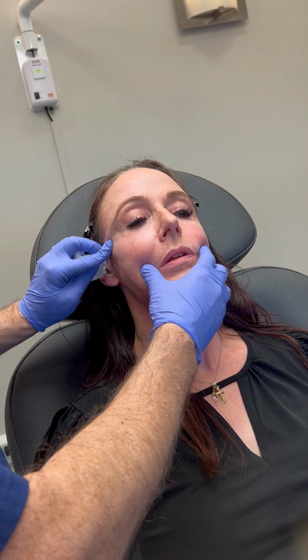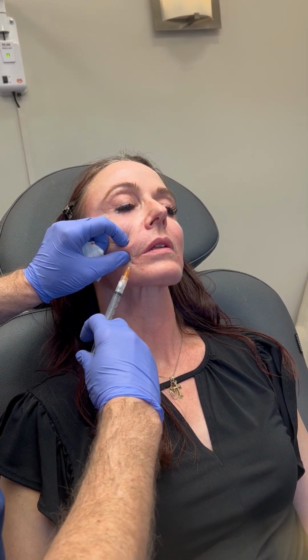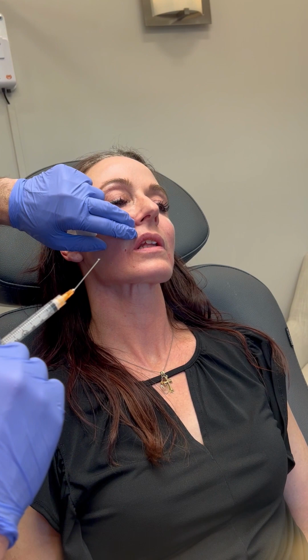So we'll do 1 cc on each side. Different ways to do this. You can go deep to bone. Again, I like to stay superficial. And this is one of those areas where you want to aspirate before you inject, because of the vessel there, so we just make sure we're clear. And we're staying just subcutaneously there.